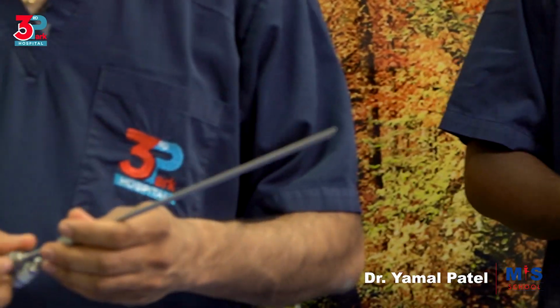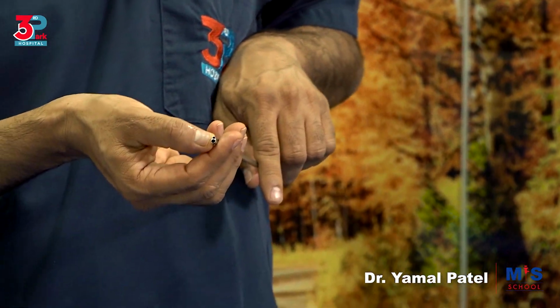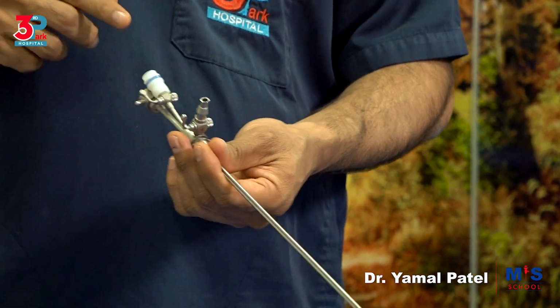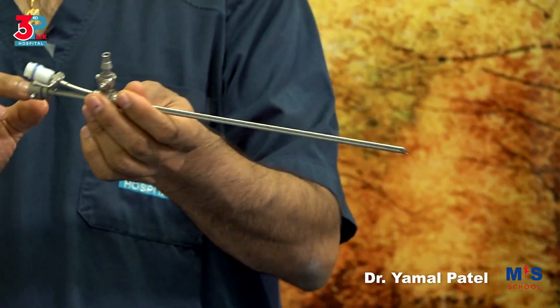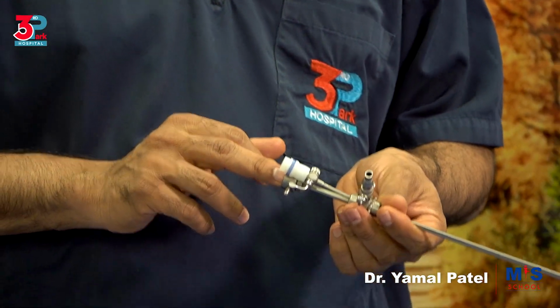Then we have the inner sheath, which again has two channels. So these two channels are connected here. One is for the operative instrument, and one is shared by the operative instrument and the fluid in, and one is the scope.